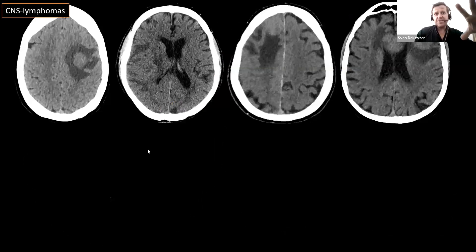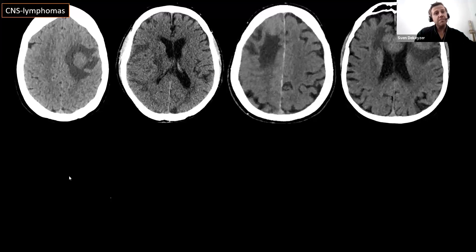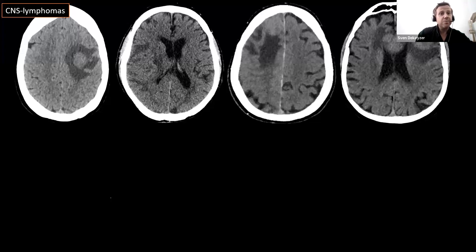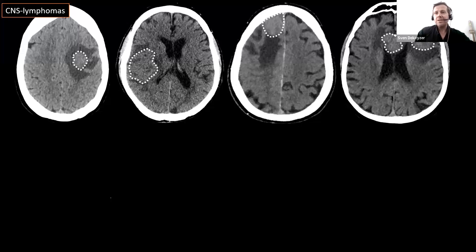In several patients with CNS lymphomas, unenhanced CT is often the first imaging performed. Patients present to the ER because of a first seizure or a neurological deficit, and the first thing ordered is an unenhanced CT. In each of these patients, we see a tumor that is isodense or slightly hyperdense compared to the cerebral cortex — so we can actually discover these tumors on unenhanced CT.